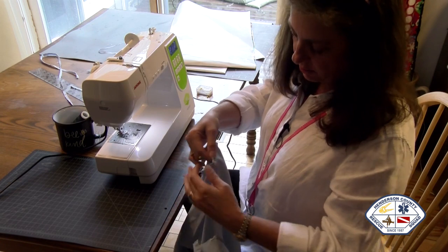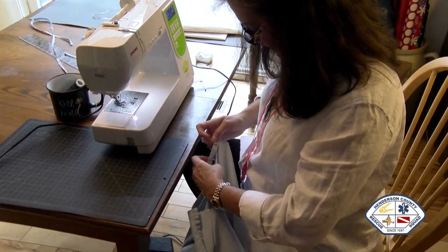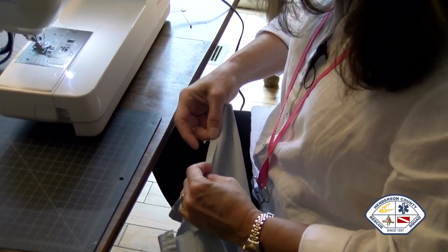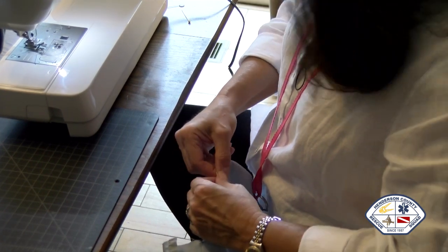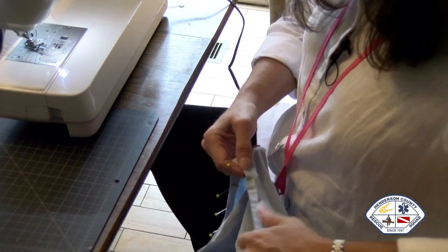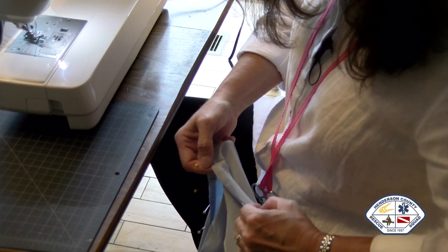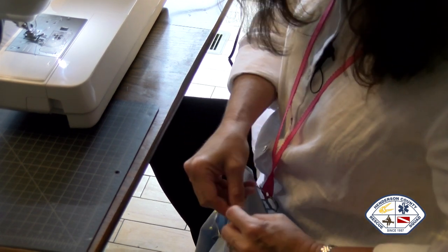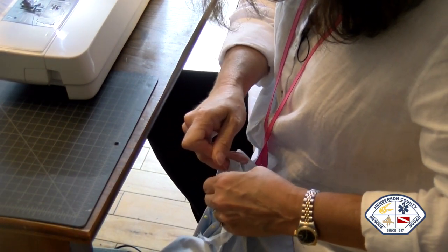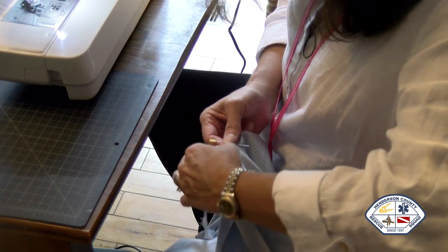Now, we started pinning our neck on already. What we're going to do now is finish pinning the bias tape or the edging of the sheet, or whatever it is you used, to, we're still going around the front of the neck of the gown. We're going to get to our seam right there where the shoulder seam comes in. And now you've got a little jig you've got to do to get around that corner.